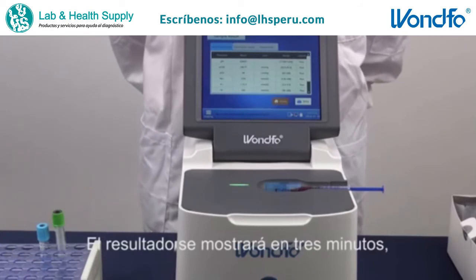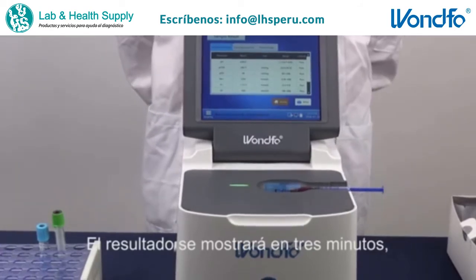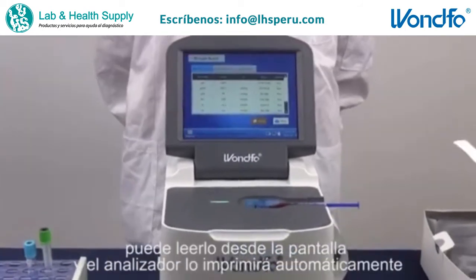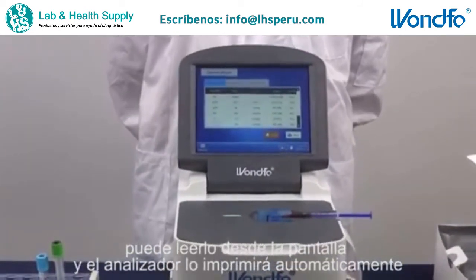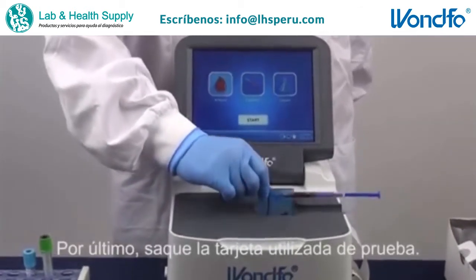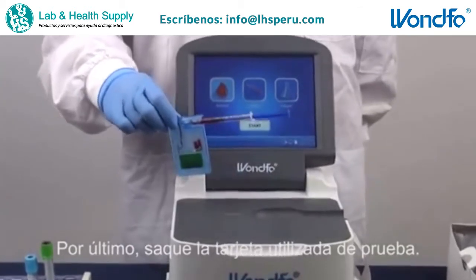The results will be released within three minutes. You can read them from the screen and the analyzer will print it for you automatically. At last, take out the used test card.